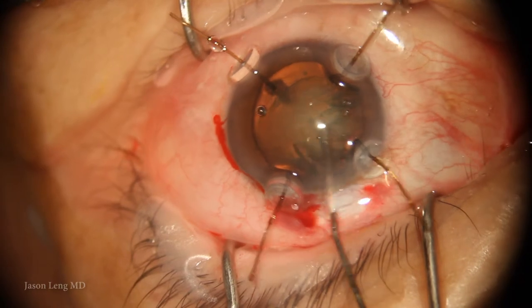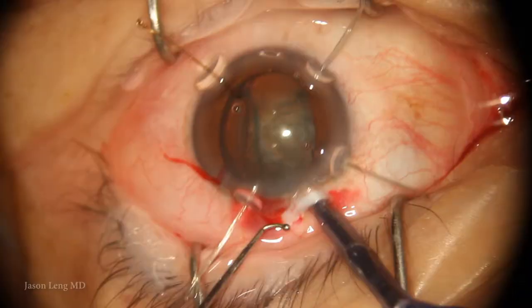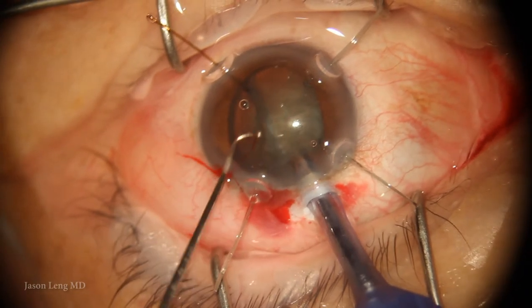During hydrodissection and trying to rotate the lens, one of the capsule hooks slips. I decided to switch some of these hooks out for the MST capsule hooks, because they're a little larger, have a larger surface area, and provide a little more stability.